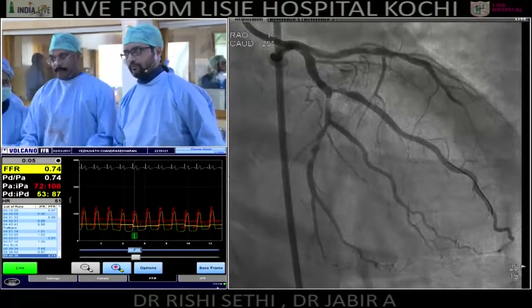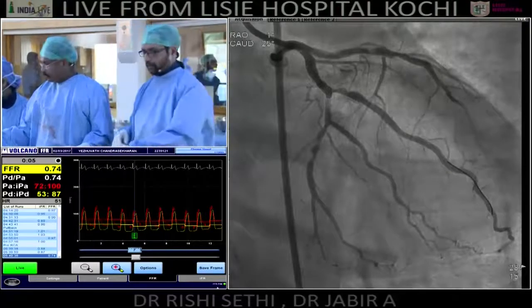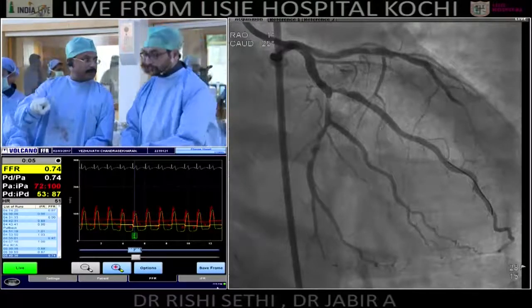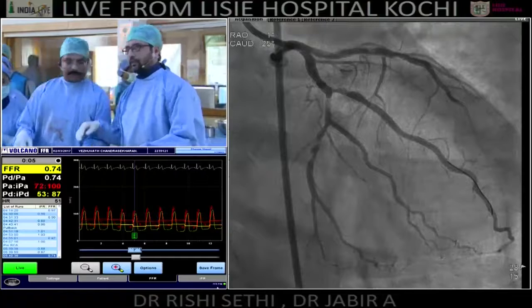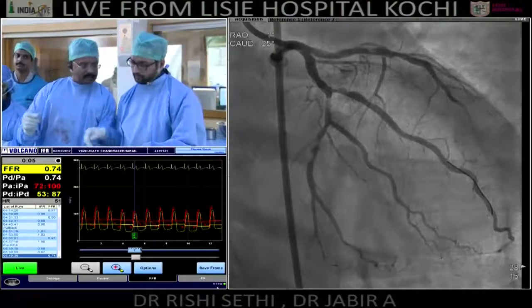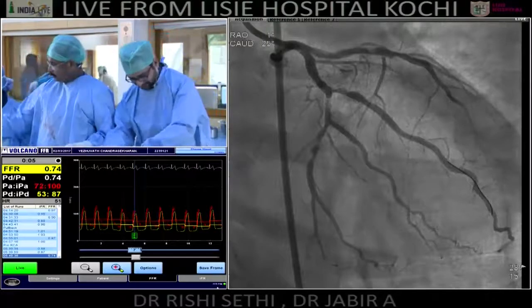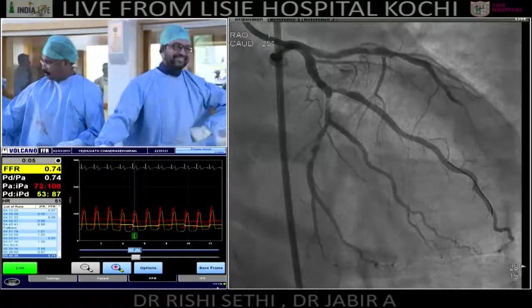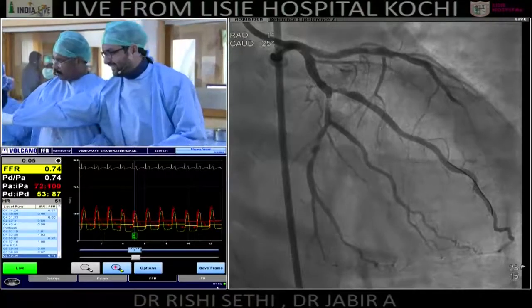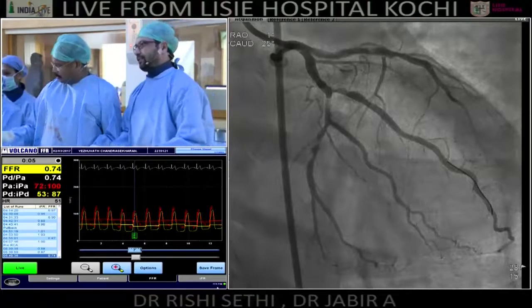Yeah. So I said follow the guidelines. Follow the guidelines. So you have to proceed according to the evidence in medicine, no? Okay. See, here the distal circumflex. Sure. 16 or 18? No, but that is 18. 2.5, 18. Brian, which guideline actually tells you to chase that OM3? I would really like to know whether this AV groove recanalization is going to benefit only that little OM3. Rishi, you can smile, but this is just from the cynics like us in the hall. Anil, I said follow the guideline. I didn't say revascularize.